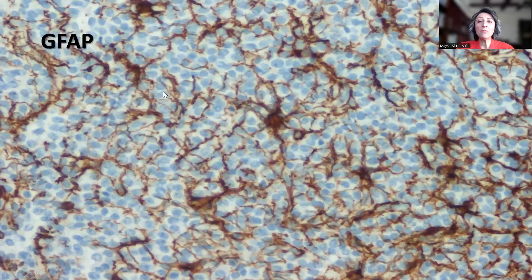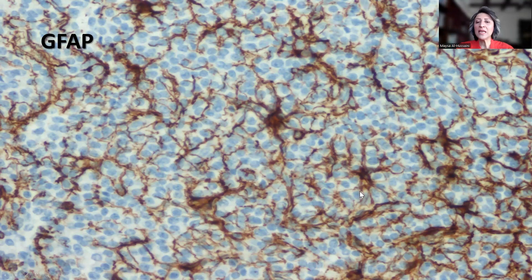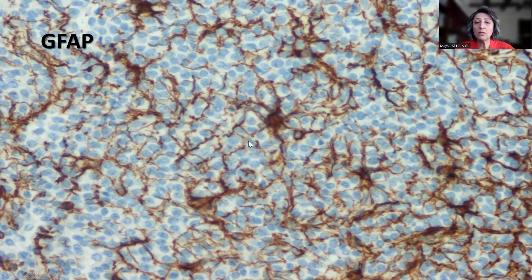With the immunostain, GFAP shows positivity. This is an astrocyte, and these are the processes of an astrocyte. What GFAP is staining here is the astrocytic framework — the base on which the tumor builds its own structure. This is not positivity in the tumor cells; the tumor cells are completely negative. These are the astrocytes, the stars, that form the main constituents of the framework of the brain.